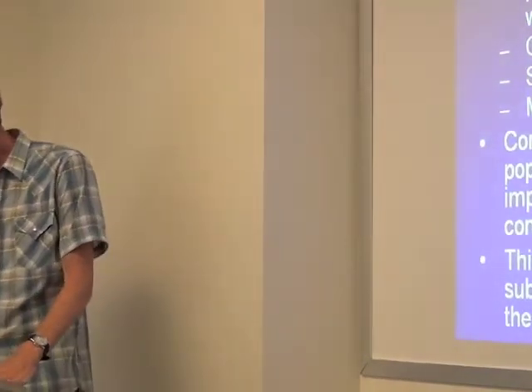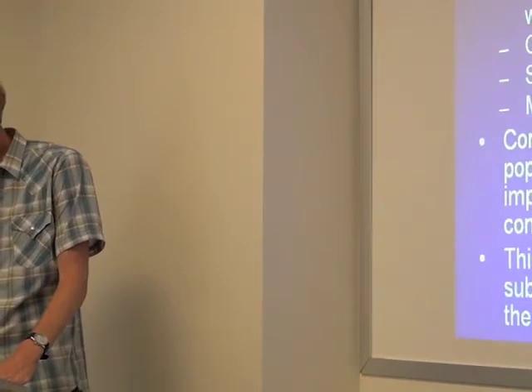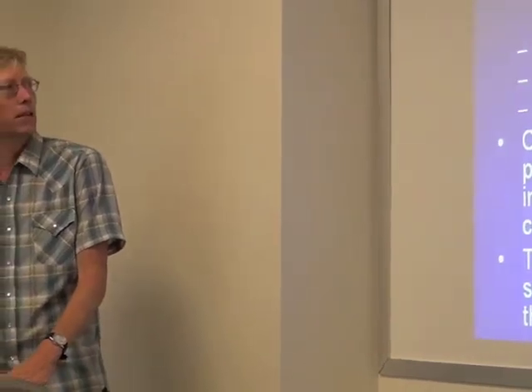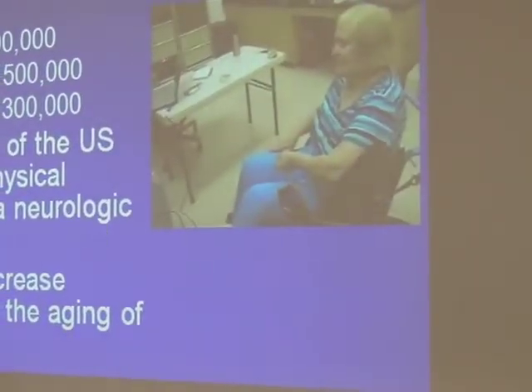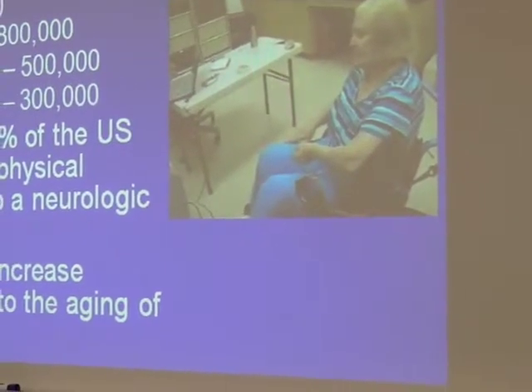And I'll show you this video. This is a volunteer for one of our studies. And in this video, I'm asking her to touch her chin. So she had a stroke, and you can see she can move her arm. That's why it's called paresis, not paralysis. But she can't touch her chin. That's as high as she can lift her arm. So we're really focused on people who are severely impaired. And how do we enable a person like this to exercise intensively?